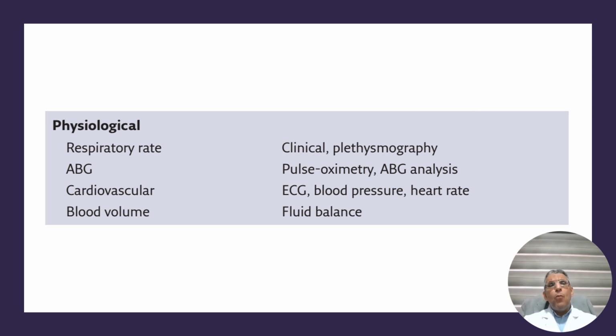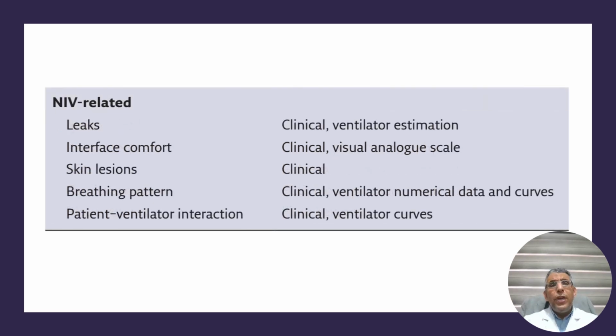Finally, the NIV-related monitoring. One of the very important items is the presence of leak. Leak is an important integral part of non-invasive mechanical ventilation, because non-invasive mechanical ventilation is semi-open. Thus, leak is inherent in the design of non-invasive mechanical ventilation. I have to search for the leak either clinically or by the ventilator, as we will discuss later on.